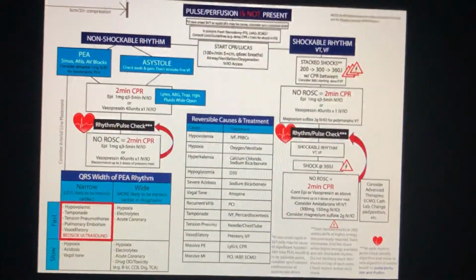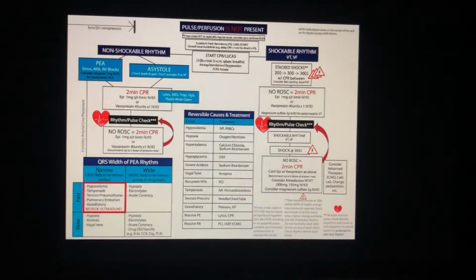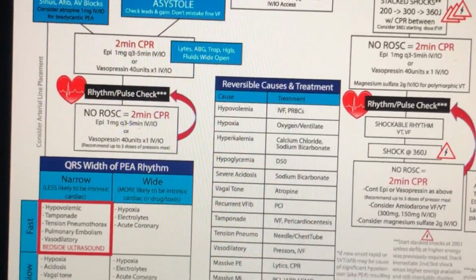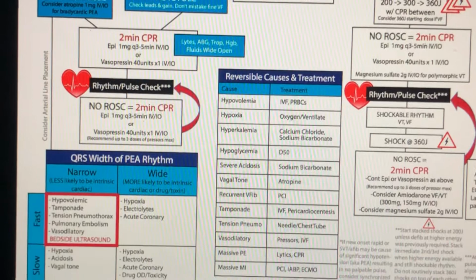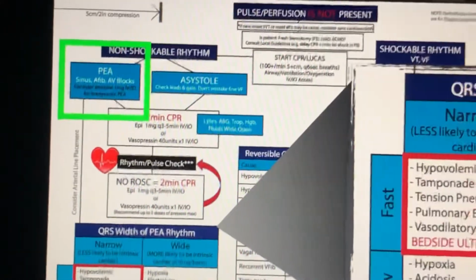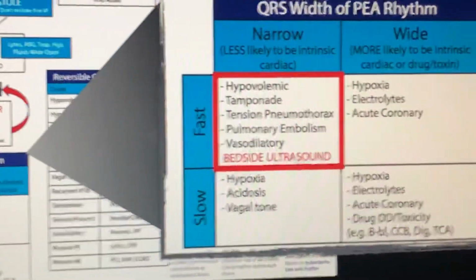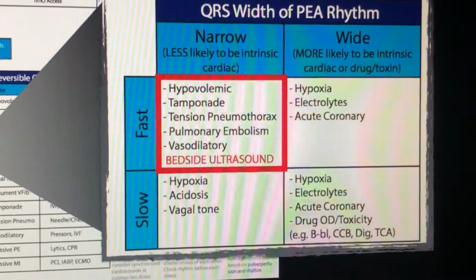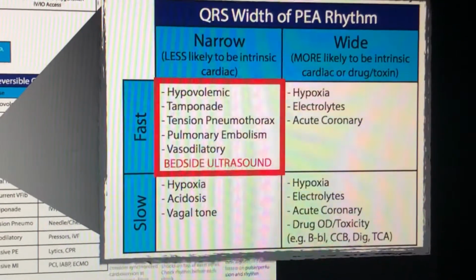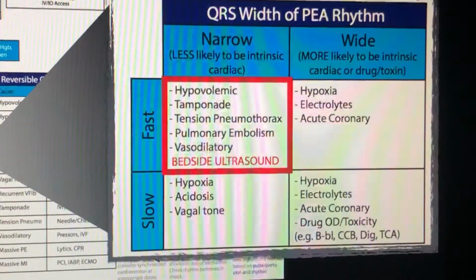Many types of coding patients can benefit from the knowledge obtained from point-of-care ultrasound. However, we're going to focus the use within some specific types of coding patients where we potentially have the greatest impact on patient outcomes. We would look at patients in a PEA arrest. Even more specifically, we would look at patients within a sinus tach PEA arrest, which, as you know, is frequently just a continuum with very hypotensive patients. This set of patients frequently has a set of conditions that are treatable in many circumstances, but will kill them if not identified quickly and intervened upon.